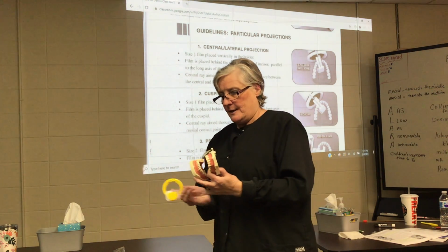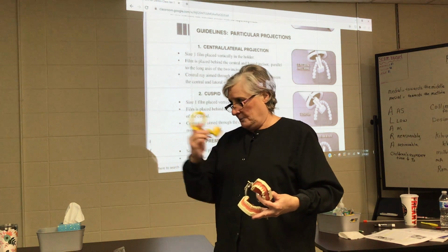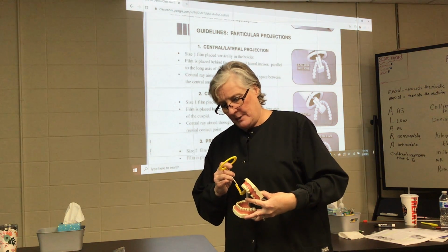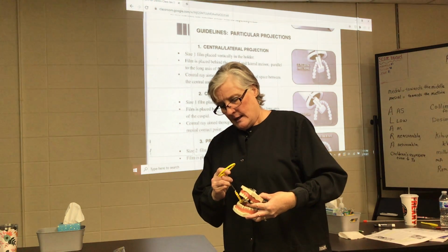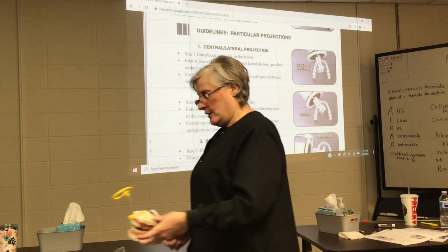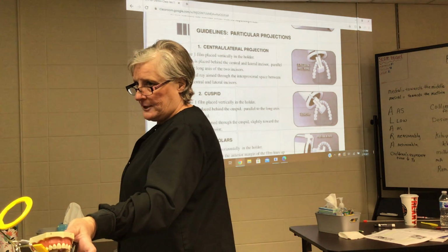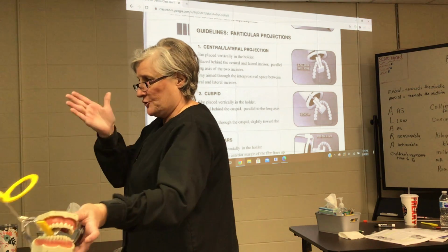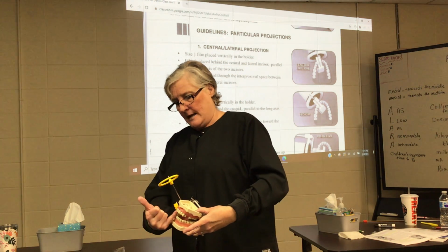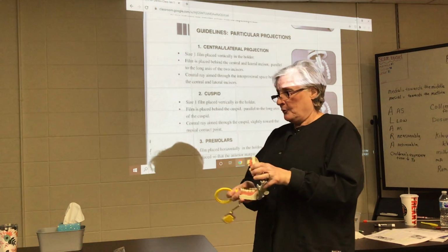So then the next picture that we do is on the same side. It's a little bit further forward. It's going to be a premolar shot. So what we're going to do is place the film at the distal of the canine, and that's going to put the film where the premolars are in the center of the film. By using the distal of the canine as your forward guide, and the molars as your backward guide, you're gonna line it up so that the premolars are centered. Then, we did the upper right.